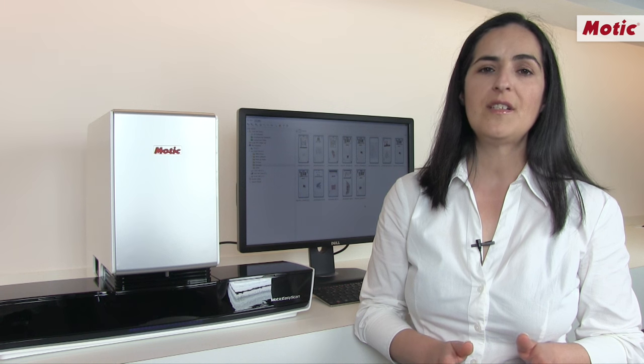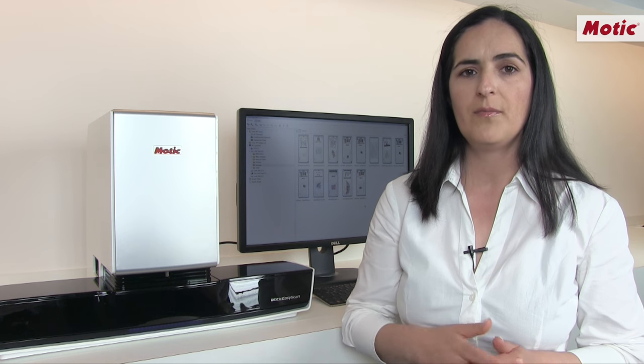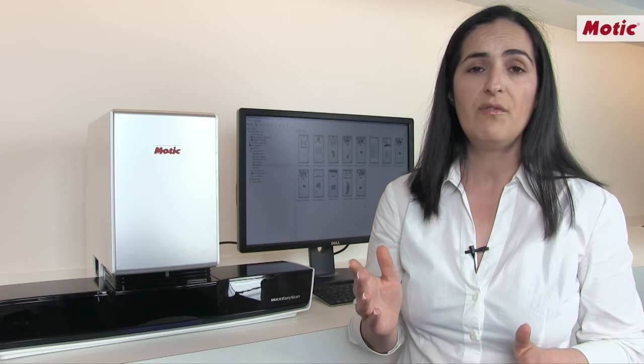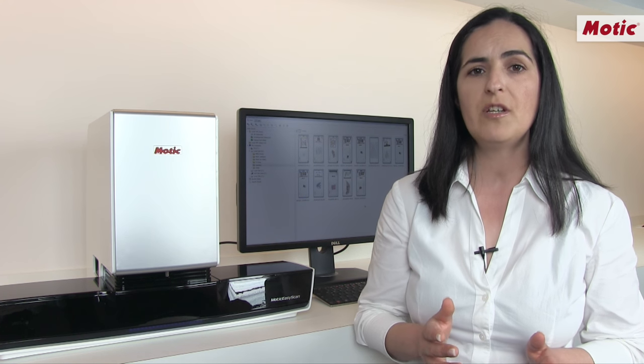The scanning process originates images which are available in a digital format through the DS Assistant software. The software includes a slide database where all the information is stored in a library, where each file is presented under the .DS format, which means digital slide format. The DS format is in fact an interactive information package which saves the information from the sample and links it with a barcode, a slide map, as well as any kind of attached documents.